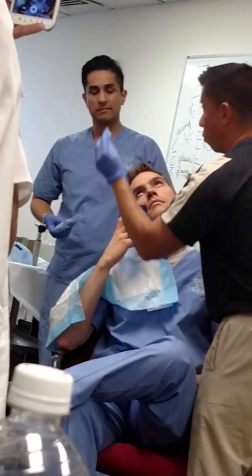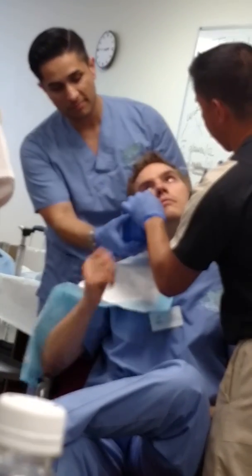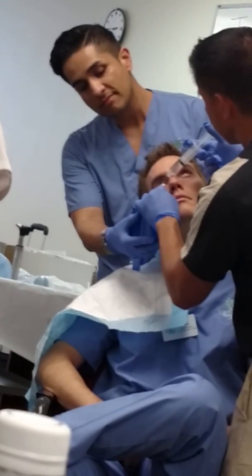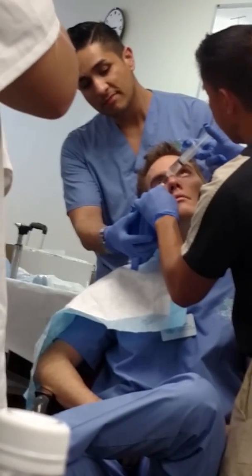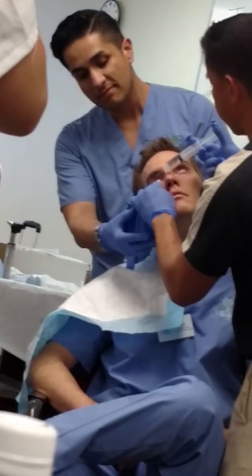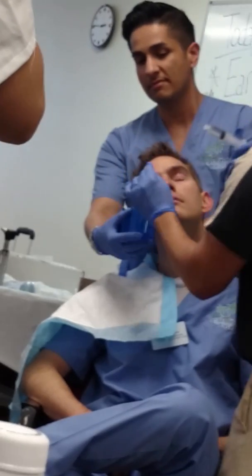Alright, so with the cotton ball or 2x2 gauze, open up the conjunctiva, the lower eyelid, and then slowly irrigate the eye from an inner to outer part of the eye. Inner canthus to the outer part of the eye. You guys with me? Want to make sure you don't hit the eyeball.